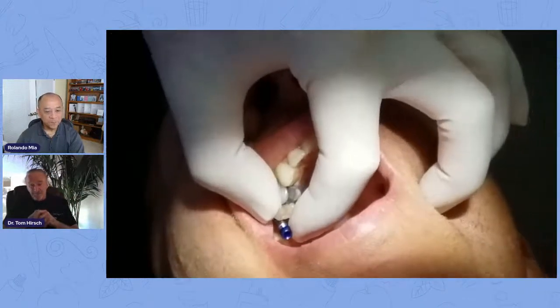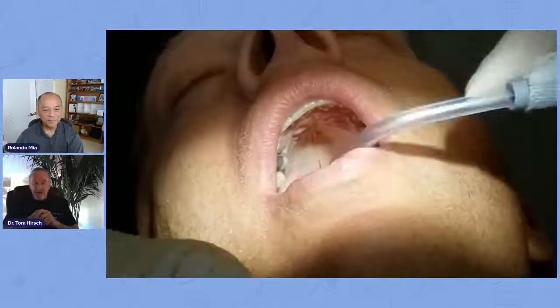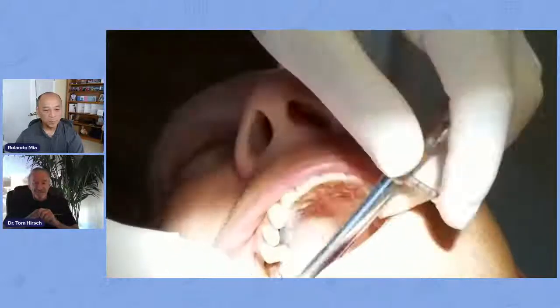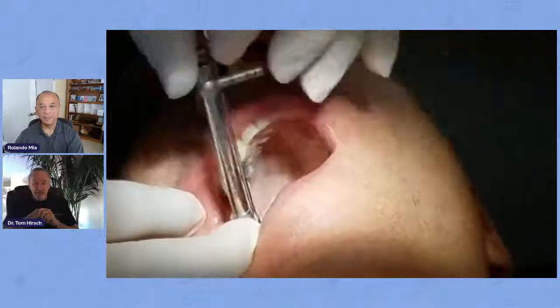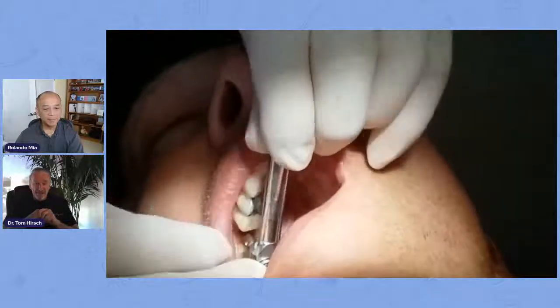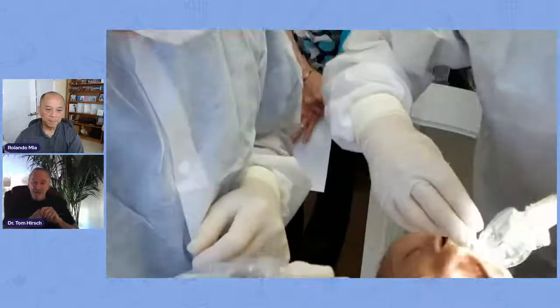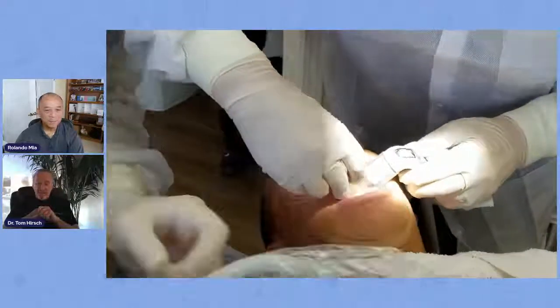Now it comes out, and we take our implant aligner. You don't always have to use the Isolite, but it just makes life easier. Now we're torquing that down to place until we get the proper amount of torque and the right timing on the alignment. And it's there. You can see when we take that out — it's really just a bloodless procedure. There's our implant placed. It's just perfectly placed.